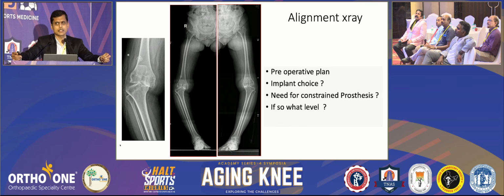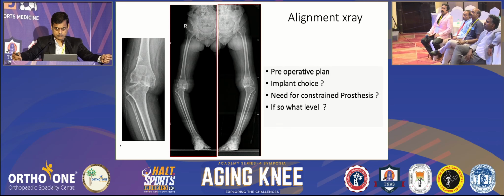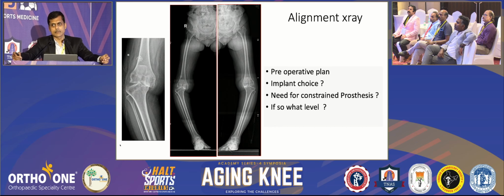Yeah. Anup, anything you would like to add apart from these points from your point of view? So the challenge here is lateral laxity, especially on the right side, which is subluxed more than a centimeter. The left side will come nicely after we remove the osteophytes. It will more or less fall back into place. But the right side may need some restrictions on KA, but the left side can be done with KA. Okay. So right side you won't do a KA in this.